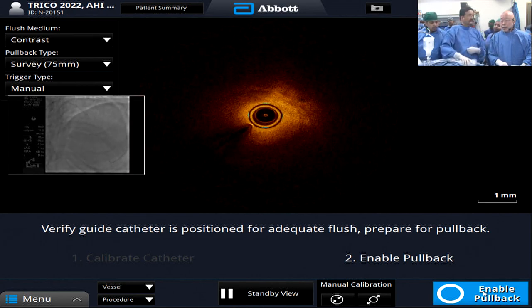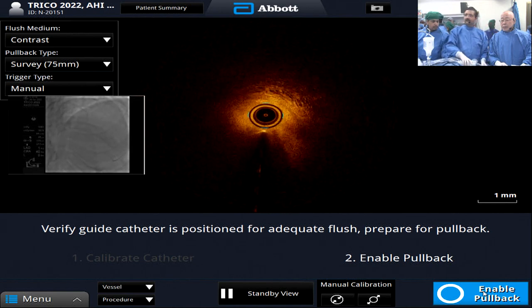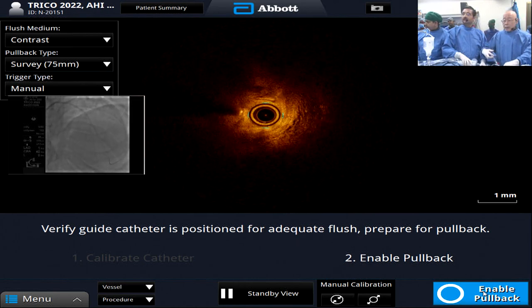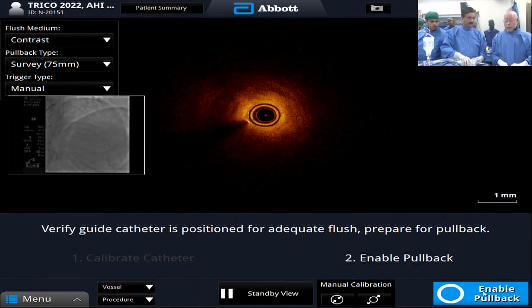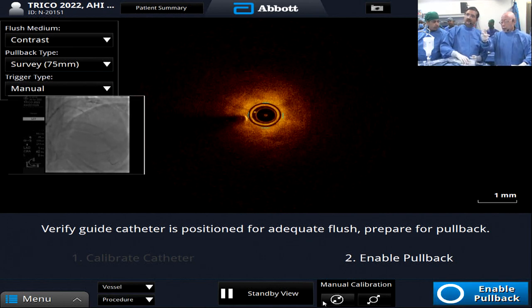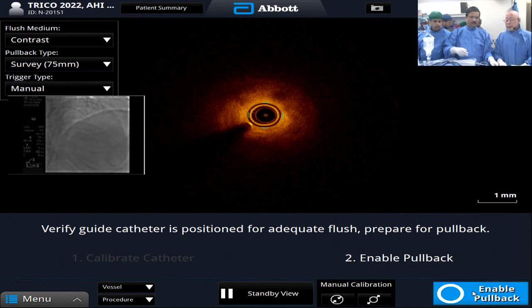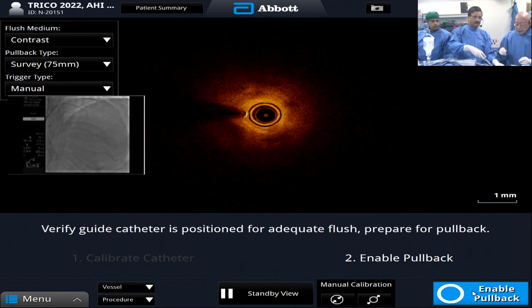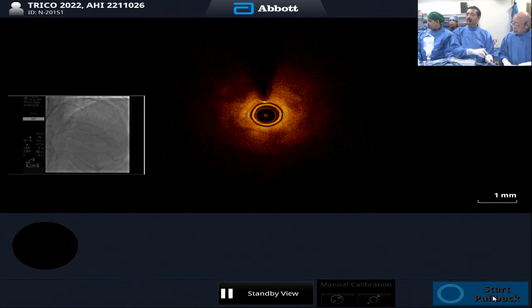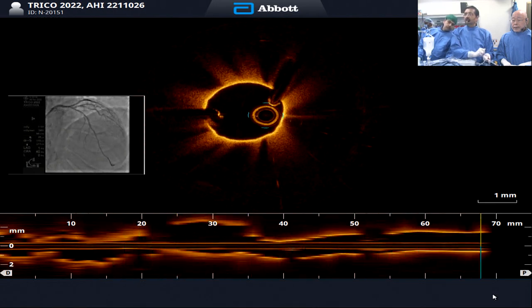Can I ask a question? What's the creatinine of this patient? I'm not sure. Does anybody have the story? Does this person have chronic kidney disease? Yeah. Well, I don't think that it really matters, because when you really use OCT the way you need to, you can do one image run of OCT and spare five or six other injections when you're working angiographically guided. So that's not the point I'm making.